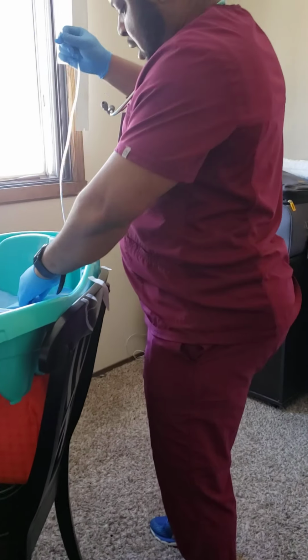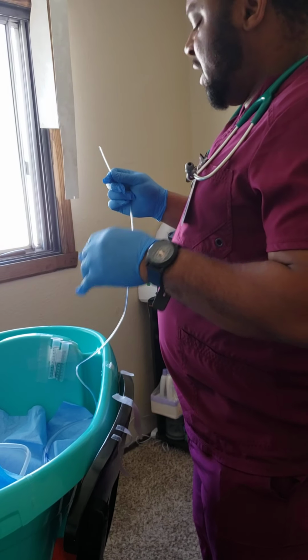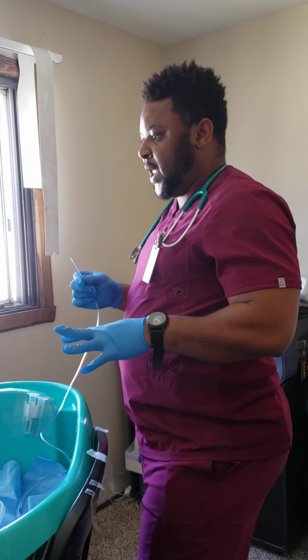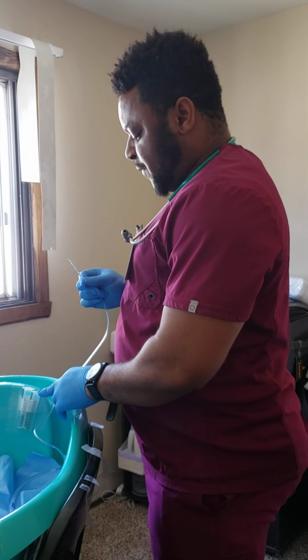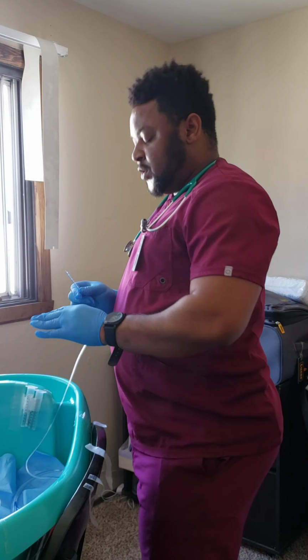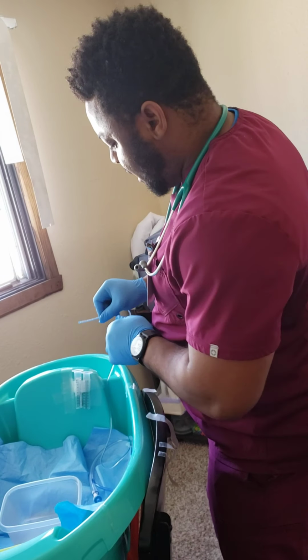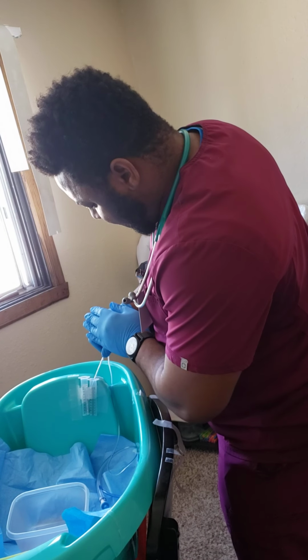Grab the tube. I also want to test the nostrils of my patient to make sure that I am inserting the tube in the nostril where the patient has good breathing. So I've tested and it shows that the left nostril is the best to insert. I want to tilt the patient's head backward and look into the nostril to make sure that there are no blockages. There are no blockages along the way. Then I tilt the patient's head backward and insert my tube.